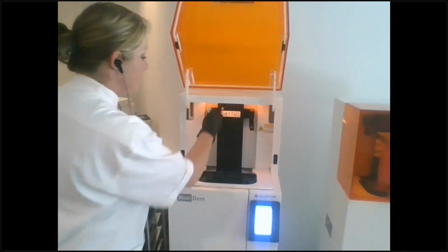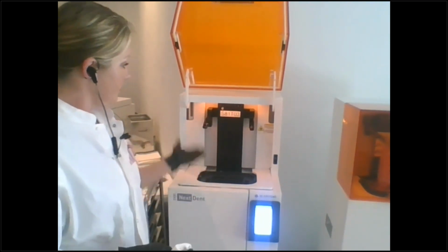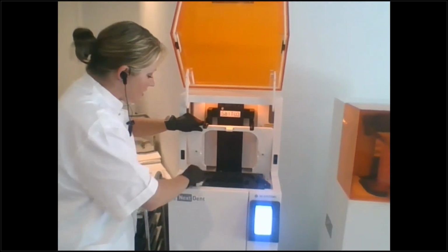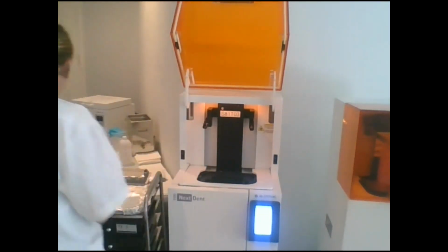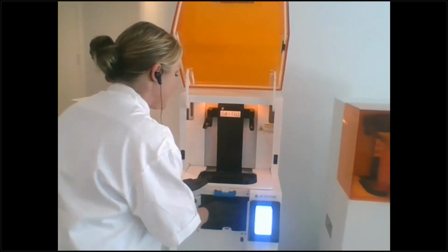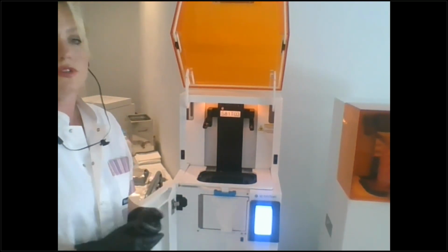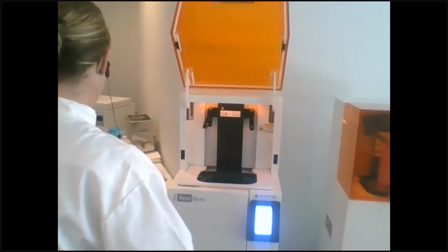There's not many moving parts, right? You have your arms. You want to make sure there's no resin on there. And you have the elevator arms that come up and down, and that's really all that is moving. You do have these little tension arms, so you can wipe that down if you've got resin on them. You can make sure that you have no dust on your resin tray, catch tray, make sure that's always installed. But other than that, that pretty much is all the maintenance you have to do. There's no calibration, which is awesome. No more years of my life wasted on that.